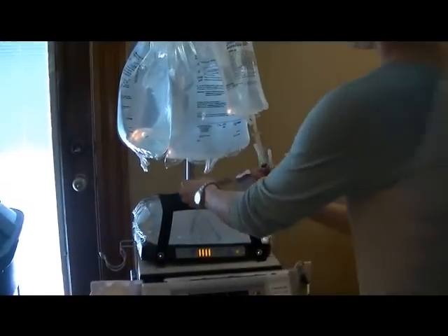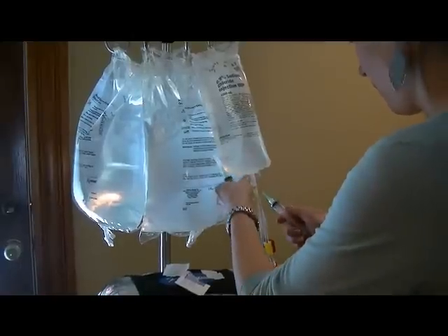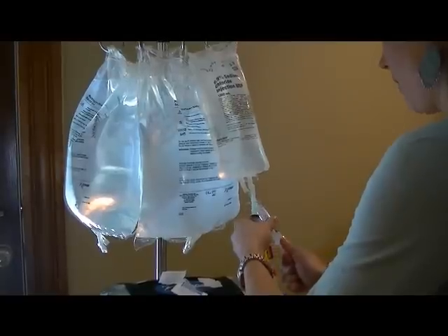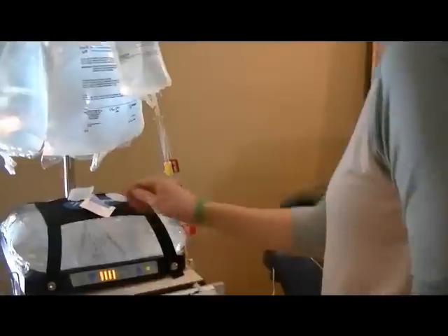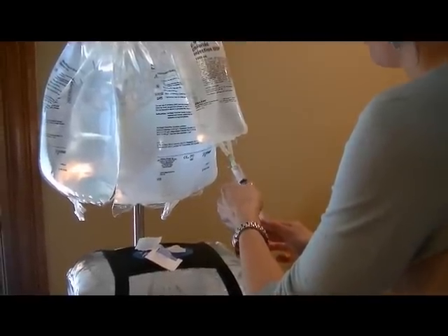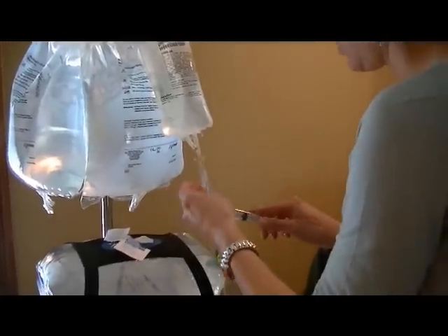Then we use saline to flush the lines whenever we stick them. We have to draw it out of this bag. We recap all the needles — even though you're not supposed to. So we've got those ready.